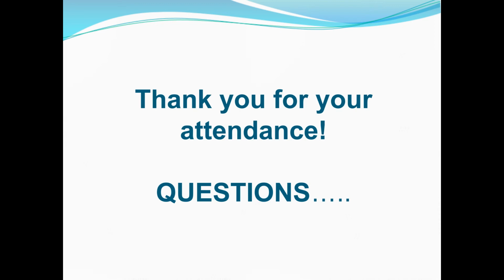All right, thank you. Our next question is, can a generalist MLT be able to perform this? Yes, absolutely. Perfect. Next question, how do we manage contamination rates? Contamination rates as far as the Sepsityper, I'm not sure. We have a technologist that looks at our blood cultures and looks at contamination rates. So that really is more dependent on our blood cultures, not the Sepsityper. I can't really speak to the fact that we've had contamination rate for the actual Sepsityper kit and performing the test, if that answers the question.